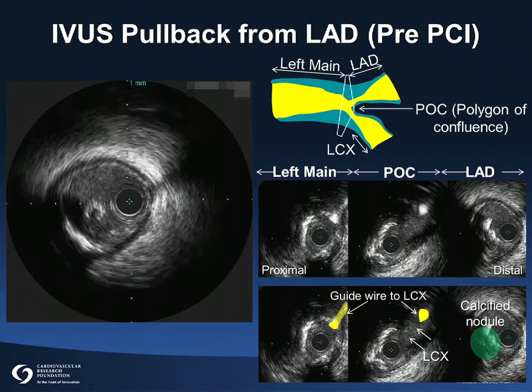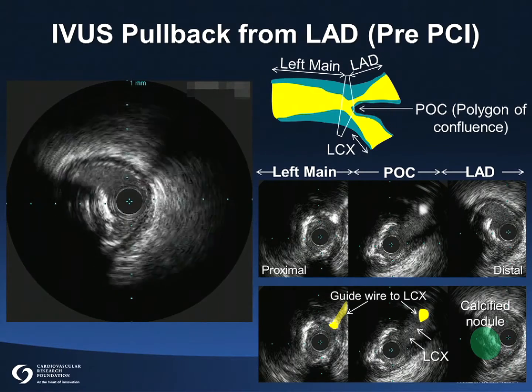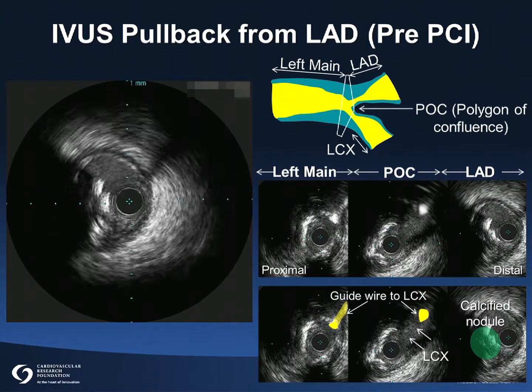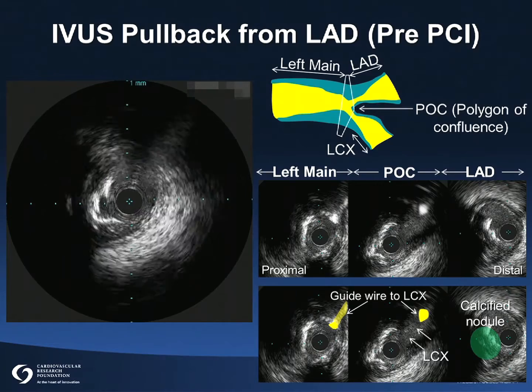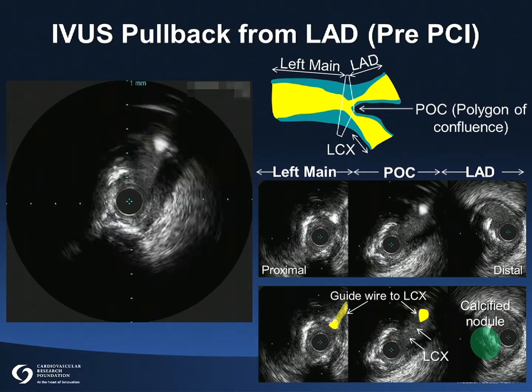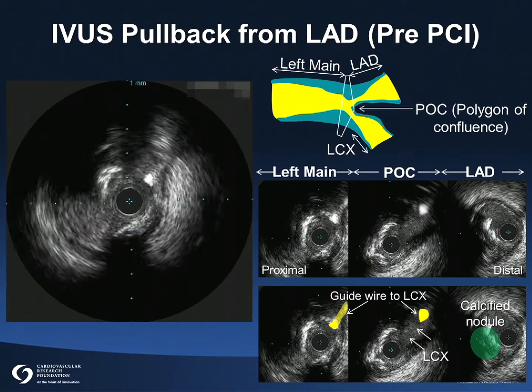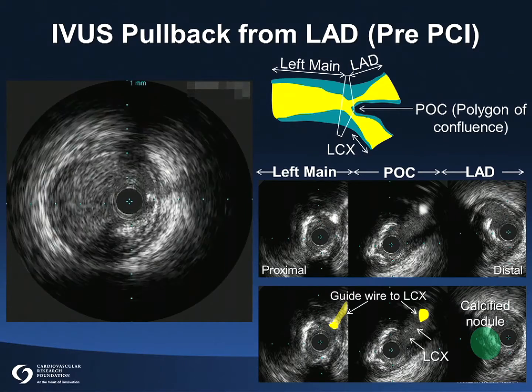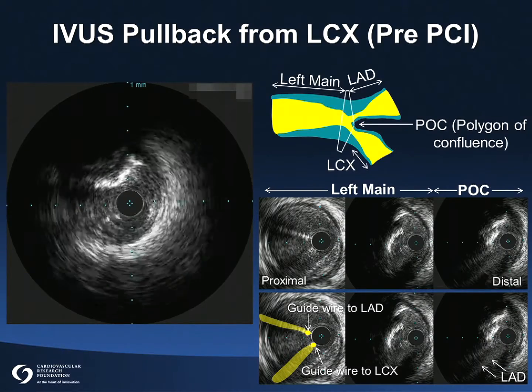We now repeat the IVUS pullback from the LAD. We now repeat the IVUS pullback from the left circumflex.